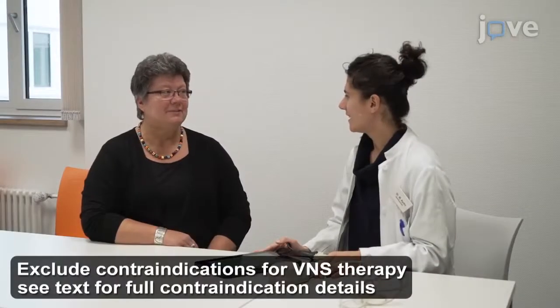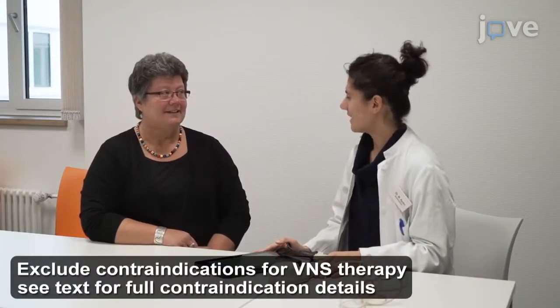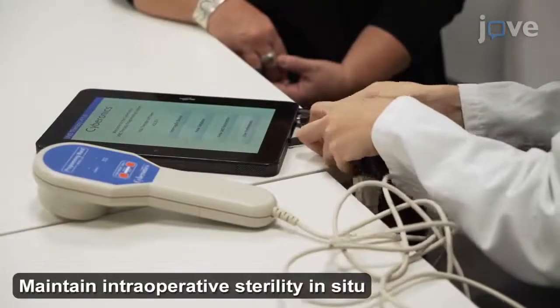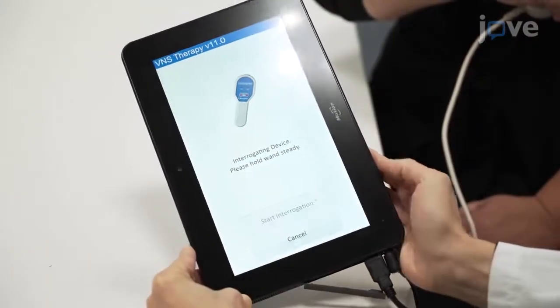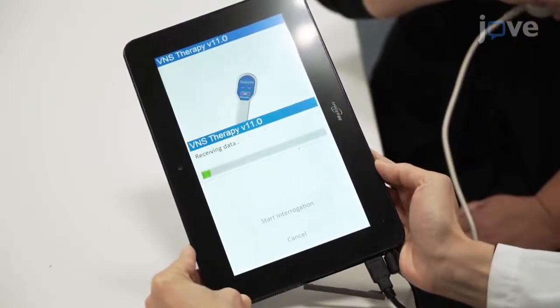After evaluating for solid compliance and willingness to attend control and tuning visitations, connect the VNS wand to the handheld device and perform lead testing with a minimum of 10 seconds of 0.5 to 1 mA and 25 Hz stimulation.